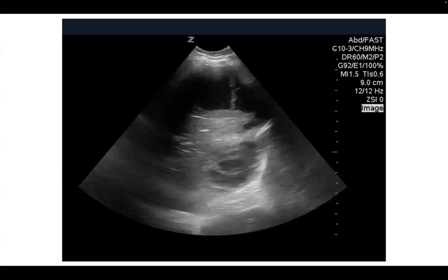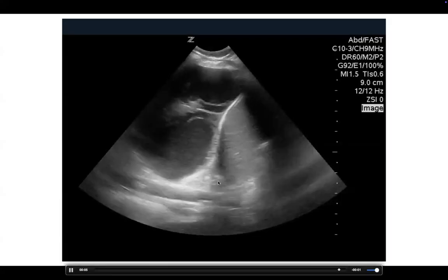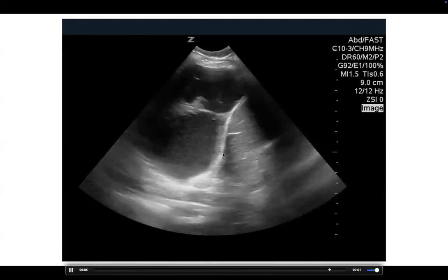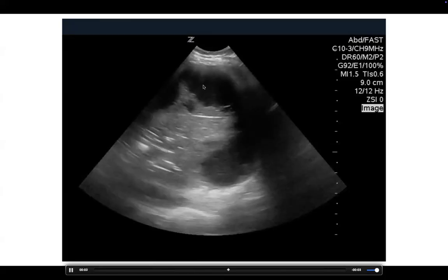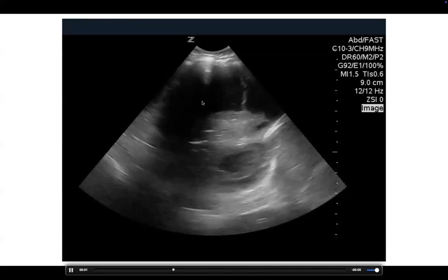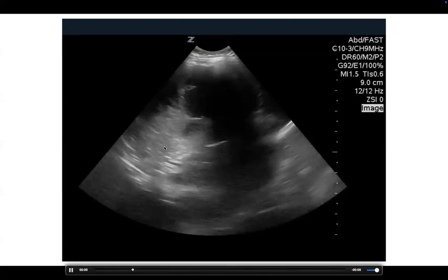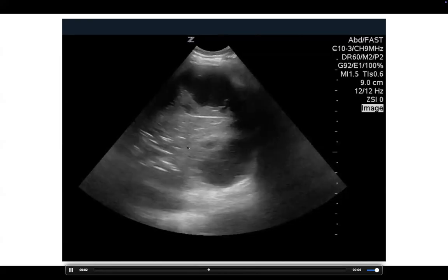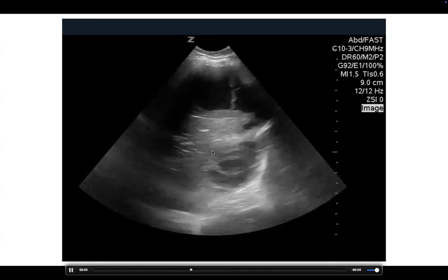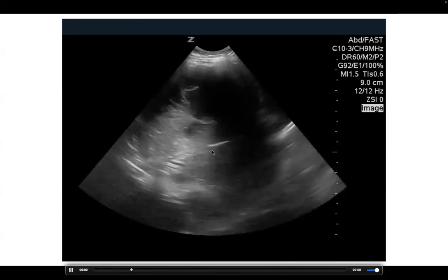It's very easy to tell, even for those of you that are not ultrasound people. There's your diaphragm here, that's your liver. All of this down here is black, and you can see all the things floating around. This is pneumonia, really bad collapsed, consolidated lung. So it's super easy, takes 30 seconds, and you've made your diagnosis and you know what the treatment algorithm is at this point.